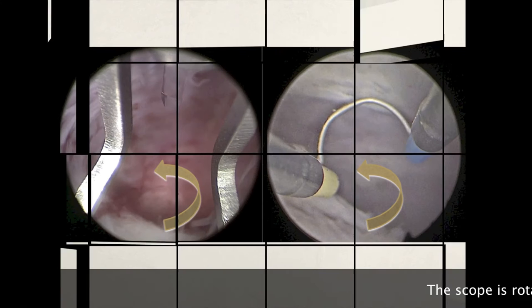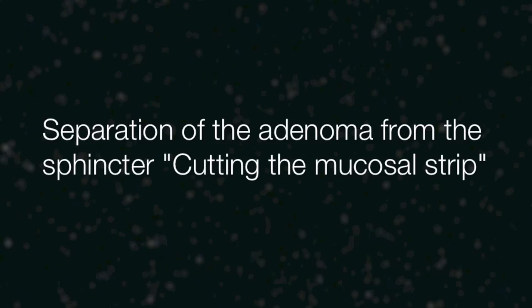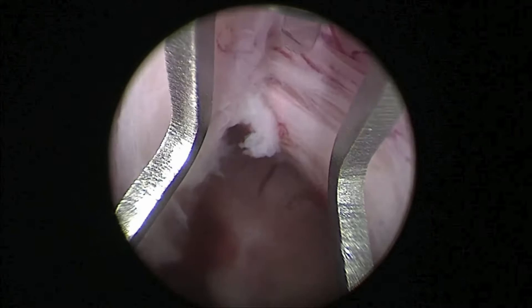In both procedures, the scope is rotated 180 degrees up and pulled out while riding over the adenoma. The next step is to separate the adenoma from the sphincter by cutting the residual mucosal strip. With the scope rotated up, the mucosal strip is identified by looking for the adenoma, sphincter, and the verumontanum.